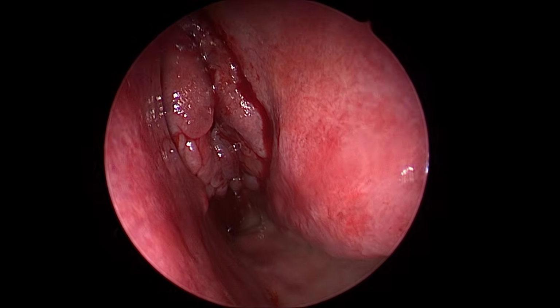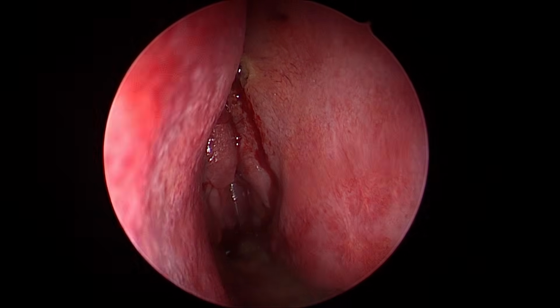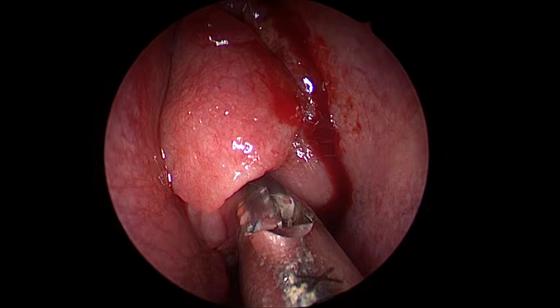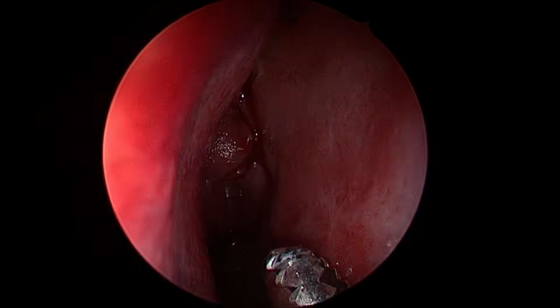Now, debrider. Now look, our turbinate is floppy, our middle meatus is full of disease. See? So first of all, I will take away these polyps to get more landmarks. You see, this is a surgery of landmarks. The margin of error is very little, so everything has to be done under vision.